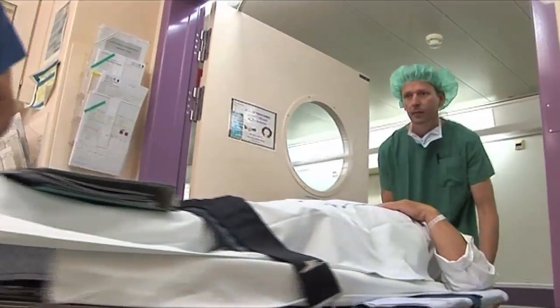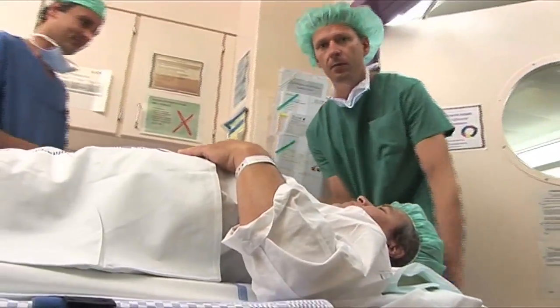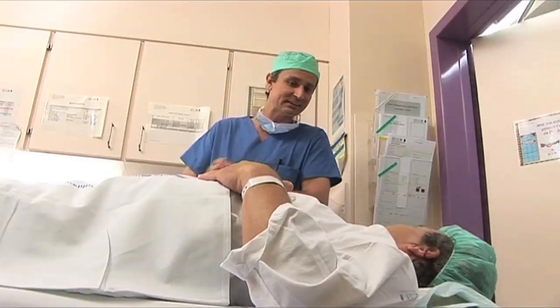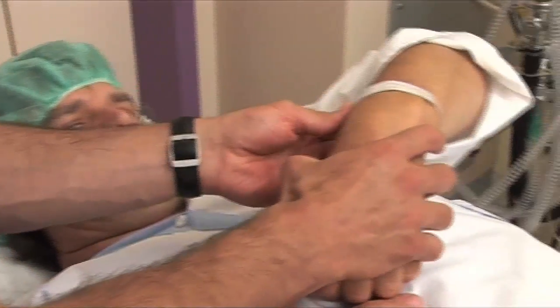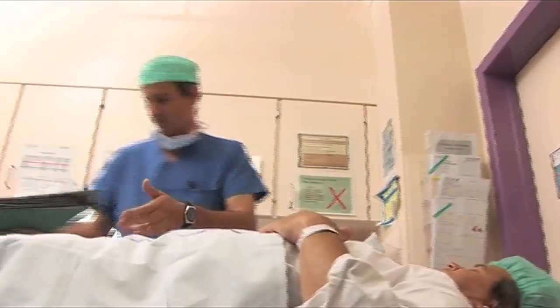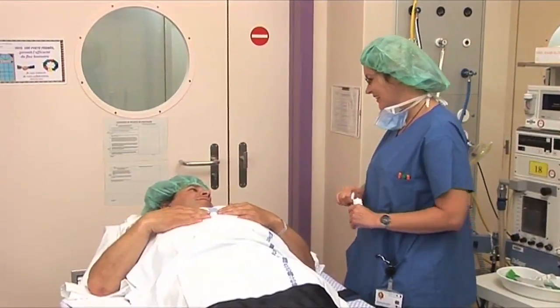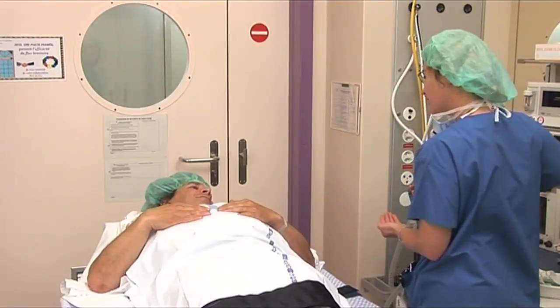They will verify your identity and the type of operation you are to undergo. The nurse greets the patient: 'Welcome to anaesthesia.' The doctor verifies: 'I'd like to verify your identity again. Your name please?' 'Patrick Martin.' The nurse introduces herself: 'My name is Stephanie. I'm a nurse anaesthetist. I'll be setting up the monitoring system as well as assisting the doctor.'